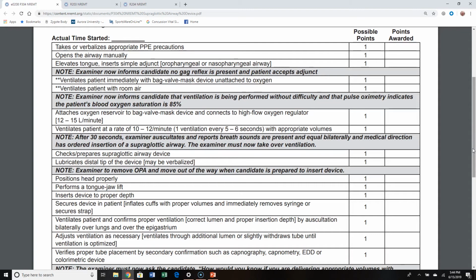So we're not just ventilating one lung and not the other; we want everything to sound clear. We also should try to verify placement by other means, which gets into carbon dioxide detection, if at all possible. These range from color-changing devices that snap into the ventilatory circuit, all the way up to the most advanced types of assessment, which would be capnography, or the measurement of carbon dioxide with a machine.